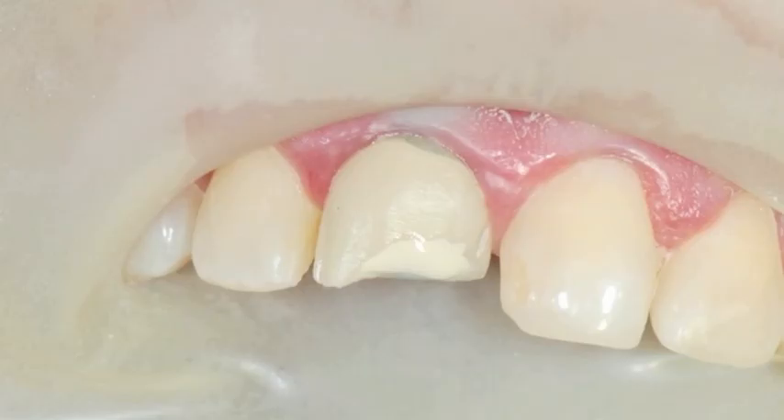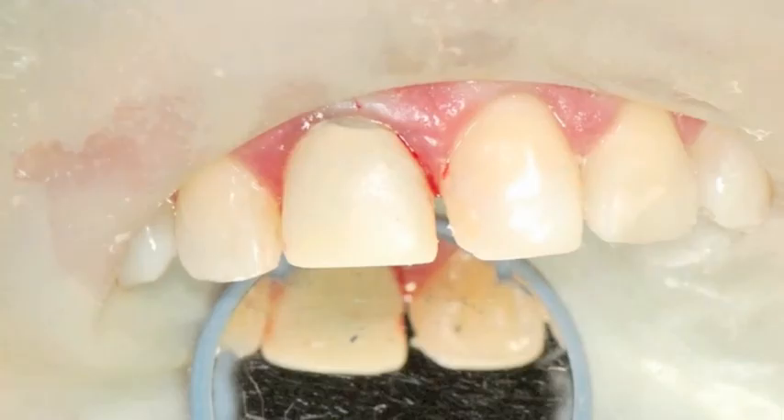The white flowable composite opaquer was placed over the exposed metal and then light cured. Using a micro-fill composite, the tooth was built up and then trimmed back to look natural.